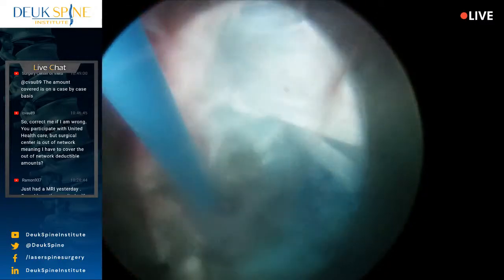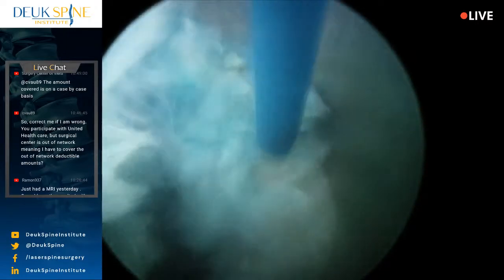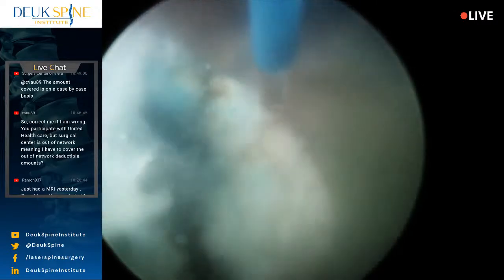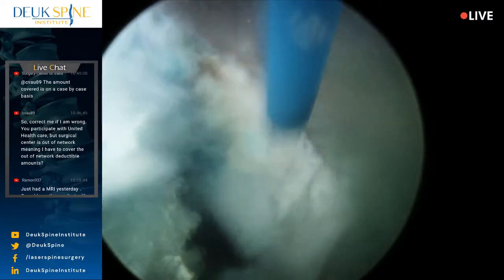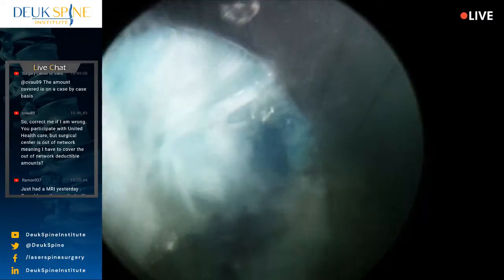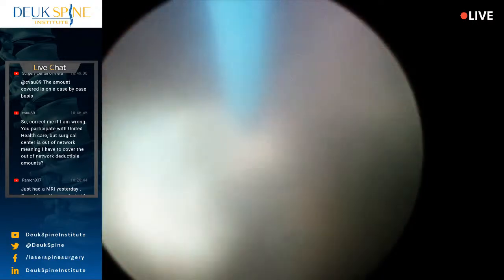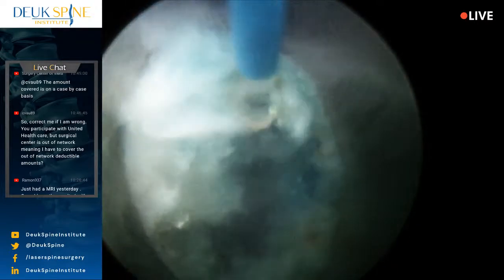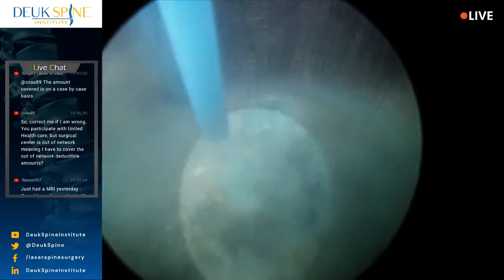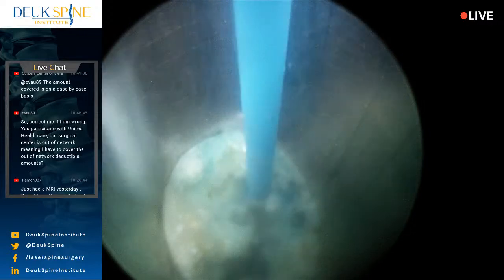There's the tear. We've been following this tear at this disc. A lot of degenerated nuclear material here that we're going to clear out with the laser. For those of you who don't know, the blue thing is the laser, and it's really just a plastic coating over the laser fiber. The laser fiber itself is made out of glass, and the glass transmits laser energy from a machine that's here in the operating room. It's about 5 feet away from me, and it transmits the energy from that machine that produces the laser beam to the end of this glass fiber, and I basically apply the laser energy to tissue.